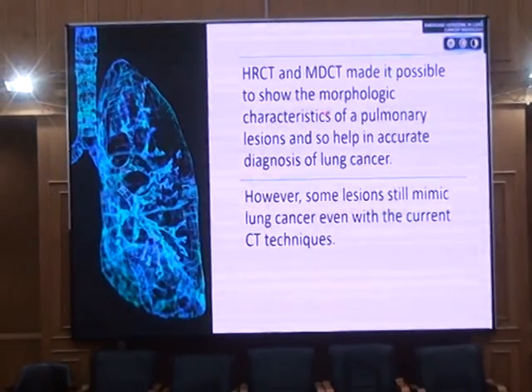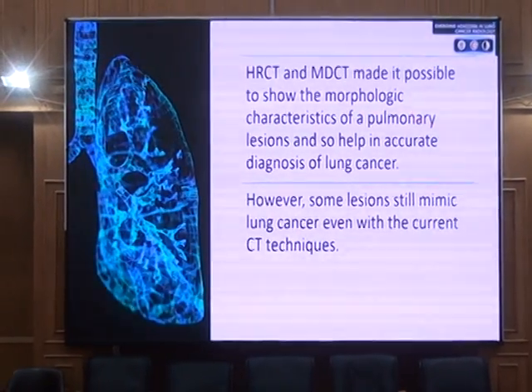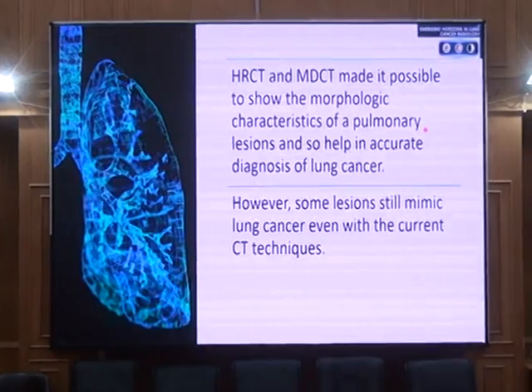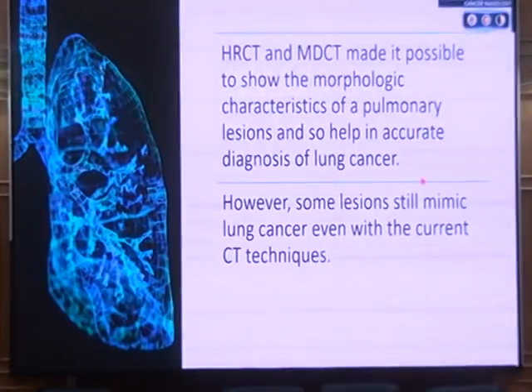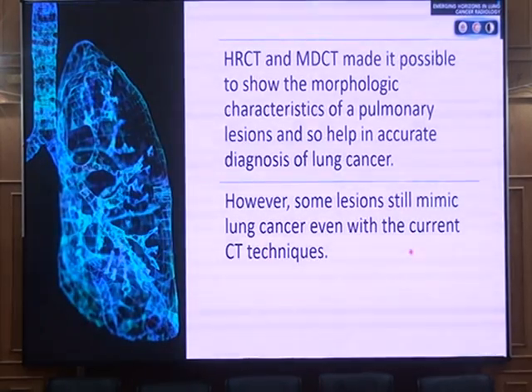In the last decade, high-resolution CT chest and multi-detector CT made it possible to show the morphologic characteristics of pulmonary lesions, which helps in accurate diagnosis of lung cancer. However, some lesions still mimic lung cancer, even with the current CT techniques.